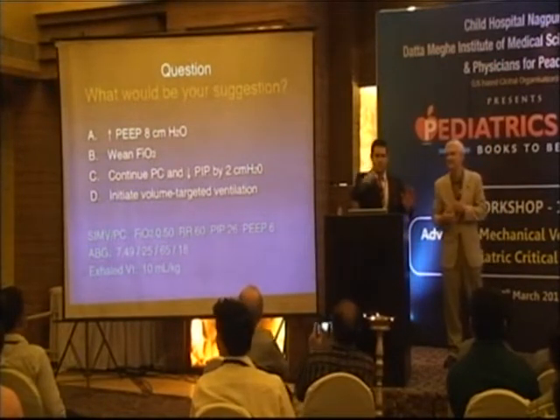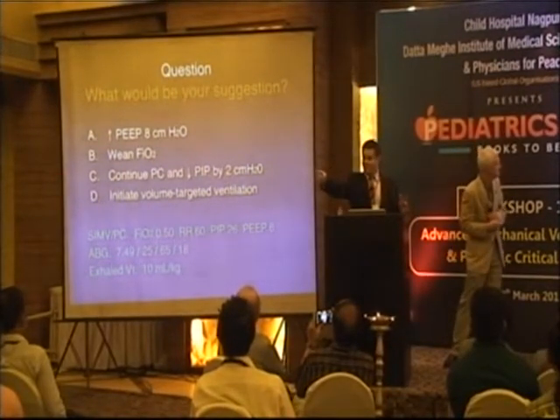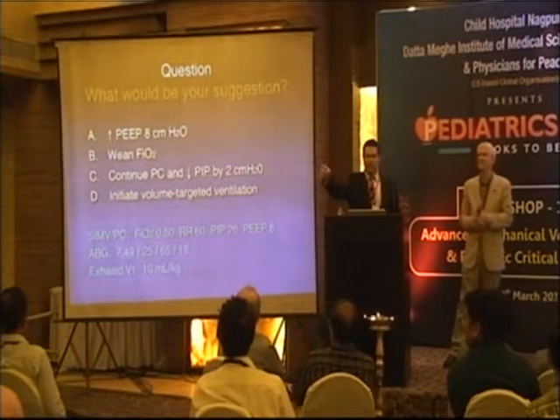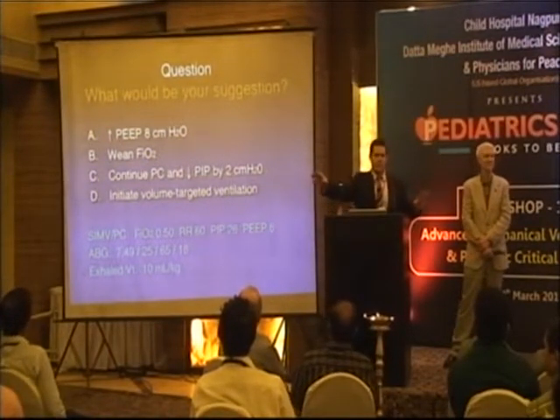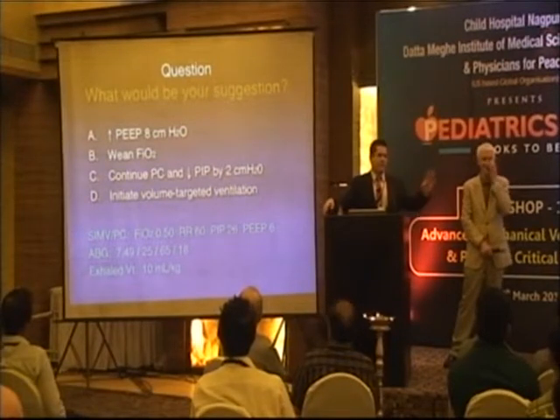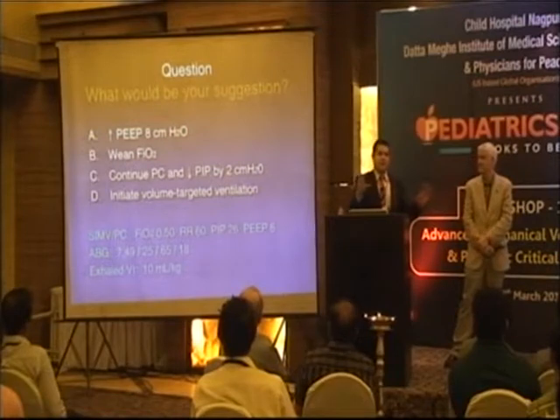There's questions. Please. Oh, you said D. D. Oh, I like that. Volume targeted ventilation. Anyone else agree with the gentleman in the front here? Volume targeted ventilation. Anyone else? I'm putting my hand up too. We might change some things today.